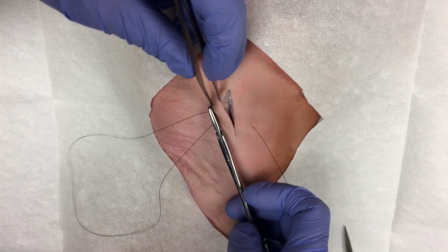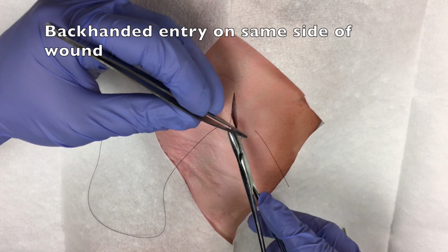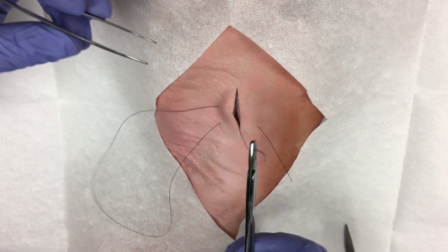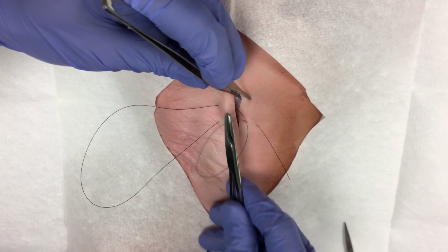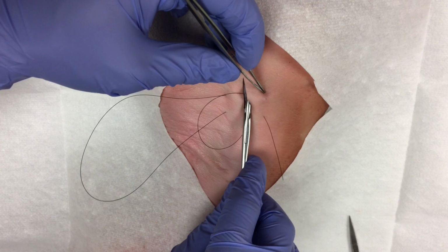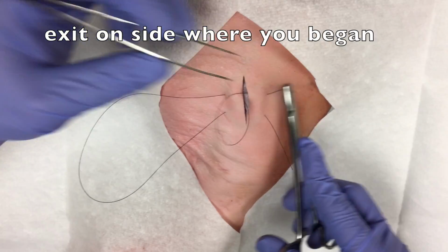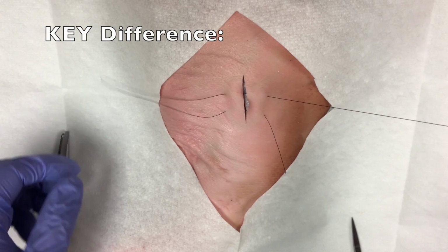You'll then walk the suture about a centimeter down on the same side of the wound, enter on the same side through the epidermis, exiting through the cut edge of the wound, and you'll reload your needle to again exit on the opposite side of the wound such that you've created a box shape, as with a typical horizontal mattress.